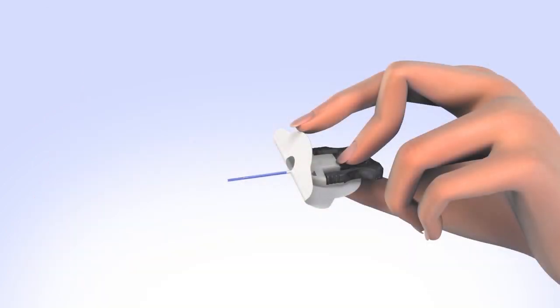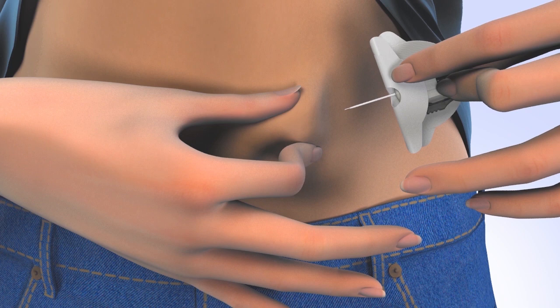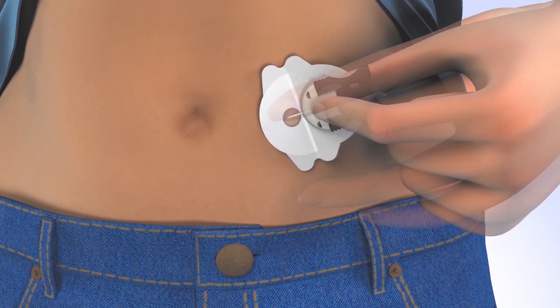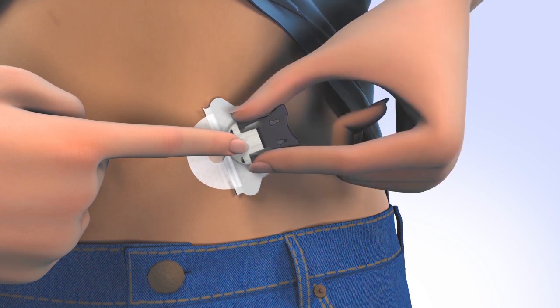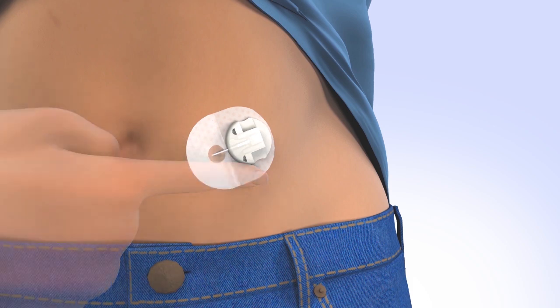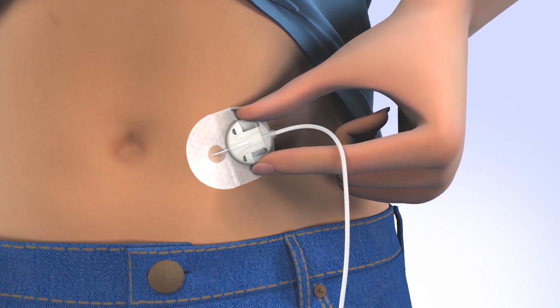Hold the insertion piece with your thumb and middle finger. With the index finger, flip the front portion of the adhesive back and hold. Remove the needle guard. With your hand, pinch the skin at the site you have prepared. Position the infusion set needle at a 20 to 45 degree angle, or as instructed by your trainer, and insert. Release the hand that is pinching the skin and continue to hold the infusion set next to the skin. Holding the cannula housing with one hand, remove the front paper backing and smooth the adhesive securely to the skin. Place a finger on the front portion of the cannula housing. With the other hand, squeeze the gray arms and pull back to remove the introducer needle. While keeping the set secure, gently remove the remaining paper and smooth to skin. Dispose of the introducer needle into a sharps container. Now, connect the infusion set tubing to the cannula housing by sliding the connector directly into the cannula housing until you hear an audible click.